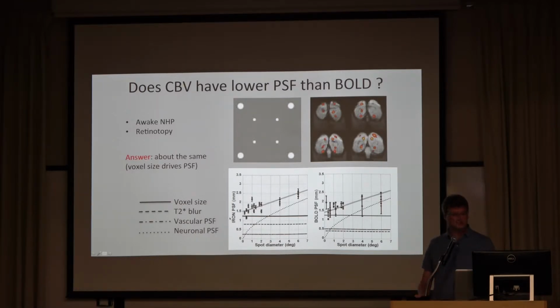So we're using retinotopy. Just sampling theory. Okay. I mean, if your point spread function turns out to be the same size as the voxel size, it just says you're limited by the sampling. Well, exactly. You're limited by the SNR. Yeah. In the end. Exactly. So we actually can, I think, pick up effects.